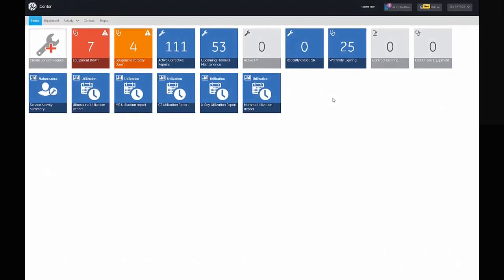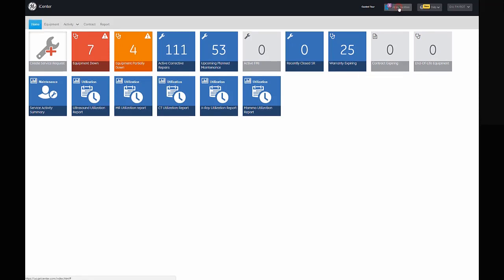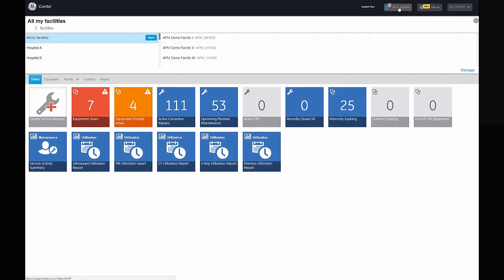To find information about equipment fleet in your organization, click on the 'All My Facilities' tab in the right top corner. You will see a drop-down menu where you can view equipment fleet in a specific facility or choose to see all facilities.